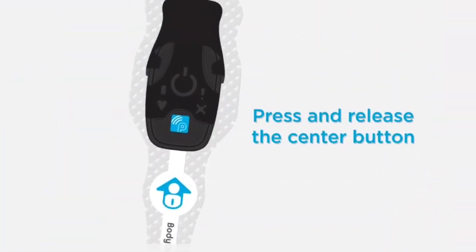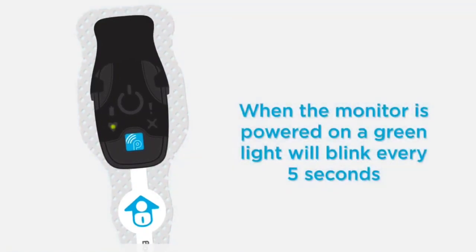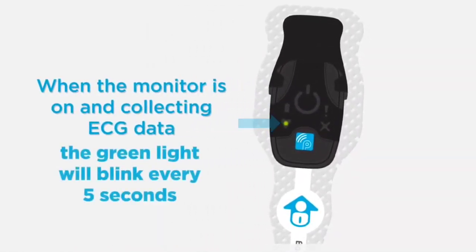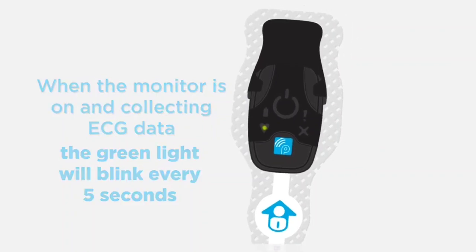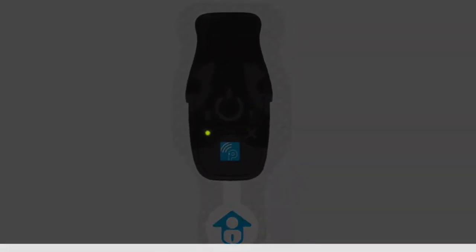Now let's look at turning on the monitor. Press and release the center button on the monitor once. As the monitor successfully powers on and contact between the strip and your skin is satisfactory, the monitor makes a quick series of three rising beeps and the green light blinks every five seconds. You are successfully monitoring. In order to tell if the monitor is on, you can check the visual indicator. When the monitor is on and collecting ECG data, the green LED light on the monitor will blink every five seconds. The monitor is designed to be unobtrusive, so the lights are faint.